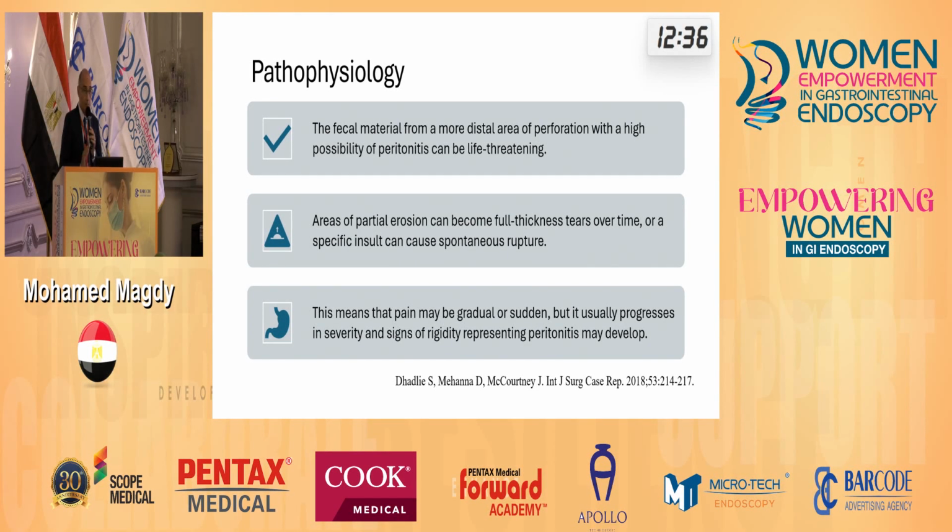Sometimes the pathophysiology differs from case to case. In some cases the complication comes from leakage of fecal content into the peritoneum, which may be a life-threatening problem. Sometimes a small perforation can spontaneously become a big perforation over time. Also, we should respect any pain during or after the colonoscopy. The perforation can present with sudden severe pain and can also be gradually increasing, progressive pain.